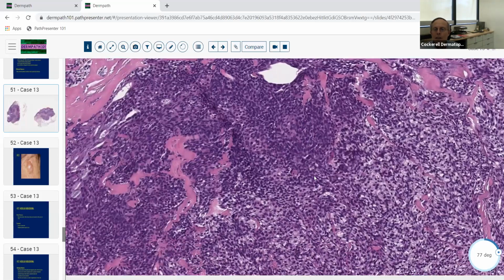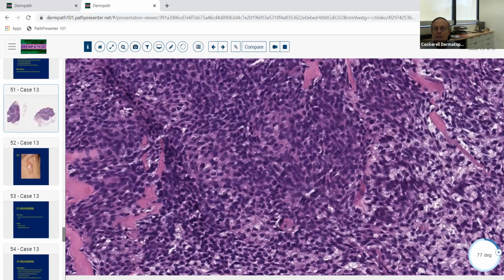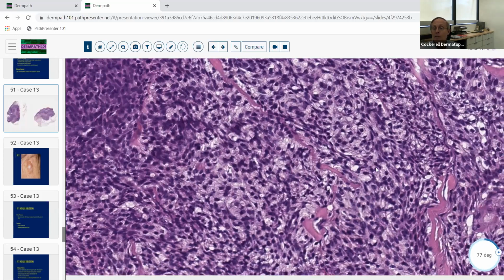The cuboidal cells admixed with the clear cells. This isn't what I would call a poroid hydradenoma. I probably just call this generally a nodular hydradenoma, or maybe even a clear cell hydradenoma, because in a lot of these areas there are clear cell features like you see here. But this is an example, again, of a benign adnexal neoplasm with eccrine or possibly apocrine differentiation.